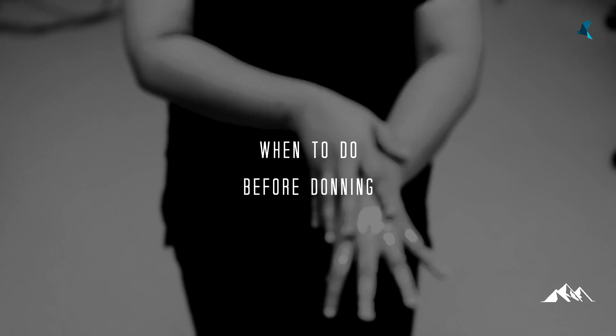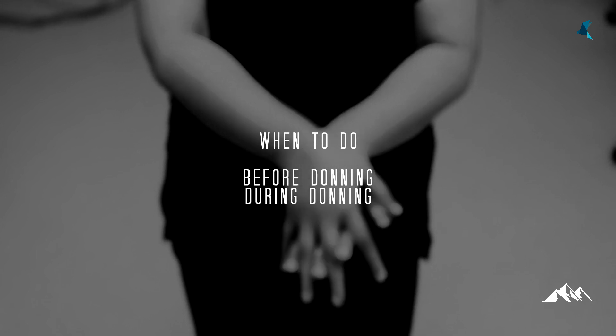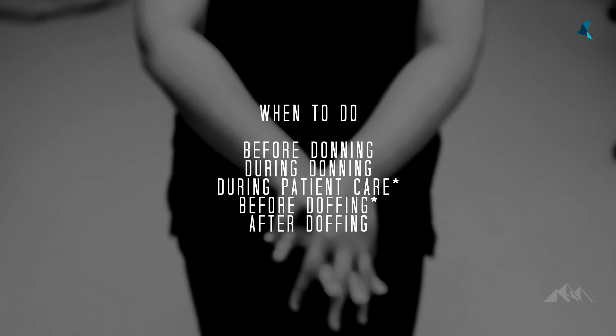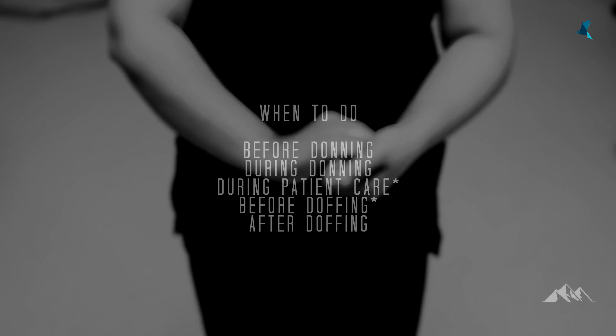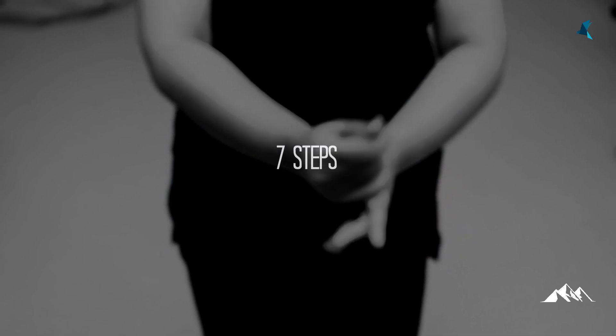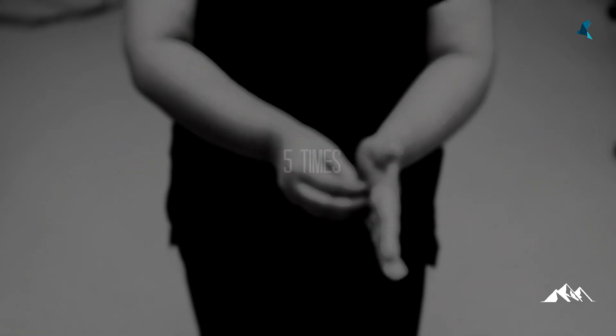Step 1: hand hygiene. Hand hygiene is performed in between during patient care and before doffing if your hand is visibly contaminated. WHO and CDC recommend hand washing with soap and water solution. If your hand is not visibly contaminated, an alcohol-based hand rub can be used as an alternative. Hand hygiene is performed in 7 steps. After washing hands with water, soap is taken and the following steps are performed. All steps are performed 5 times.